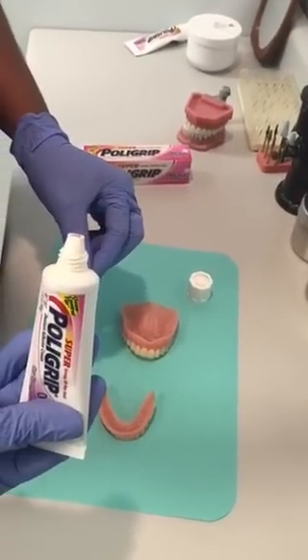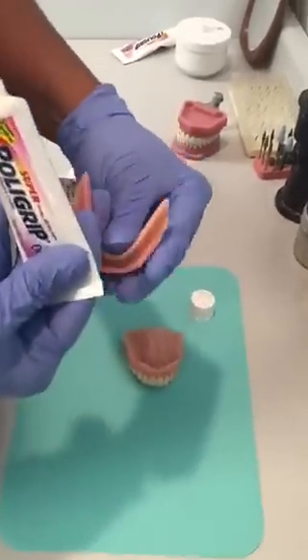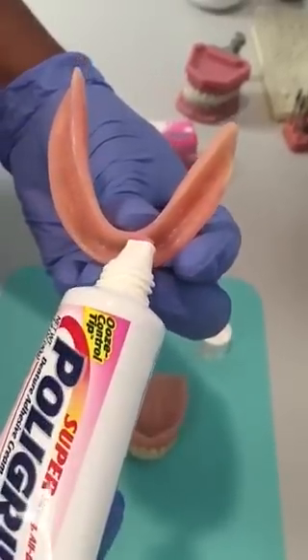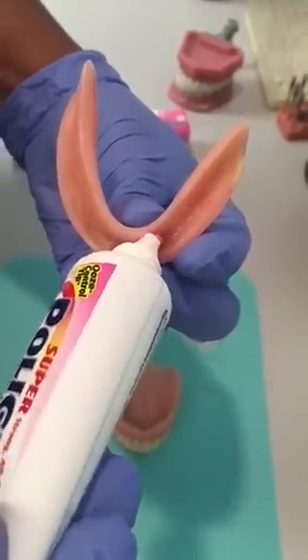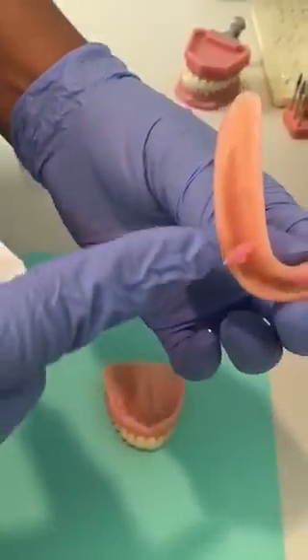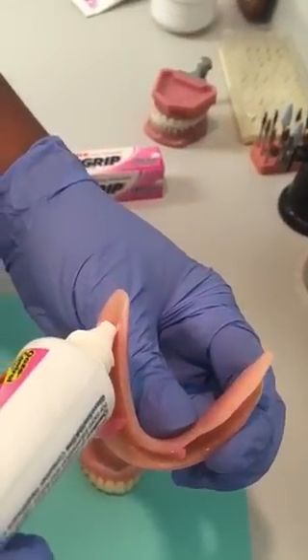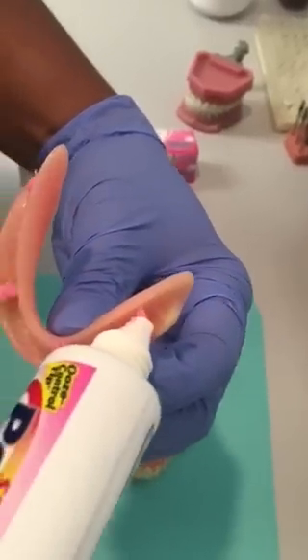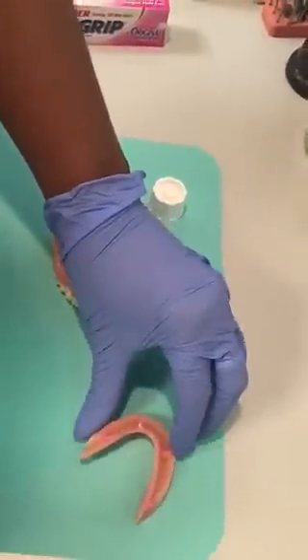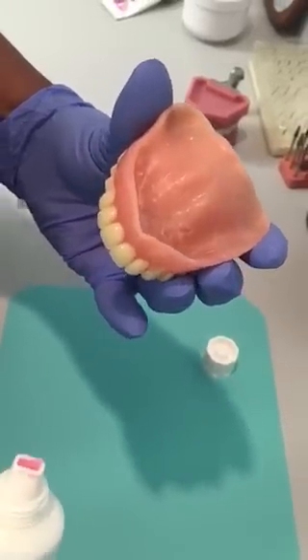You squeeze just a tiny little bit — I'll hold it this way so you can see — and place a tiny pea-sized drop in the area of the eye teeth. Just a little drop, and at the back near the molar area. That's for the lower — a little pea-sized drop.